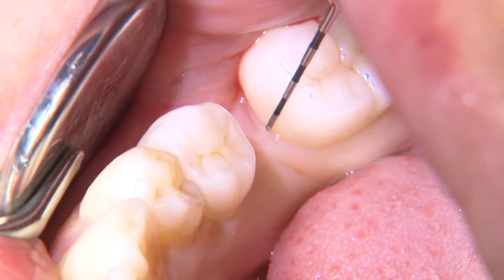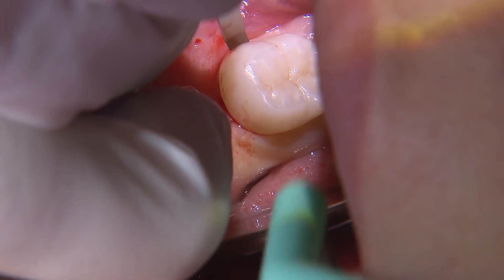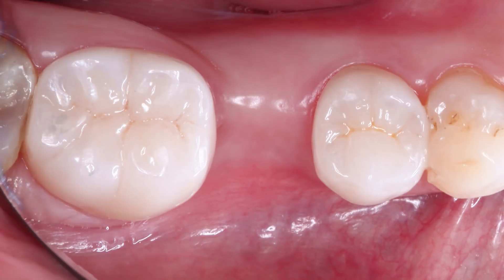Thank you Megan. For this case of the week, I'll take you through the clinical procedure of the placement and restorative process for my first implant case that I introduced in episode 213. My patient is a healthy 38-year-old female that had her lower right first molar, number 30, extracted in 2008 and restored with a fixed partial denture from 29 to 31. A few years later she was convinced to remove the pontic and attempt shifting the second and third molars mesially with Invisalign to close the space.